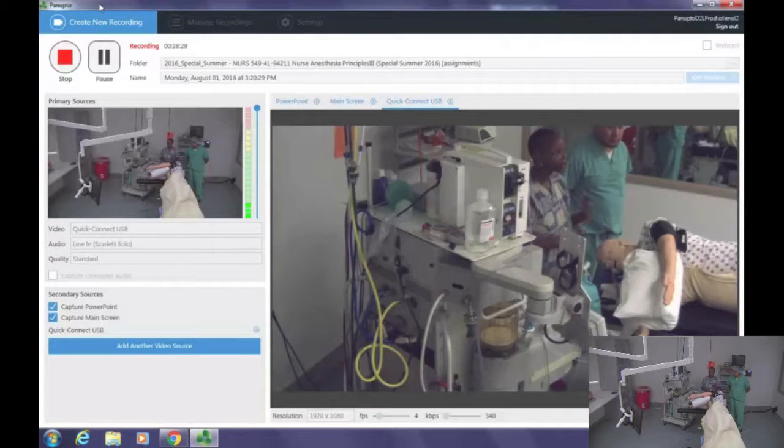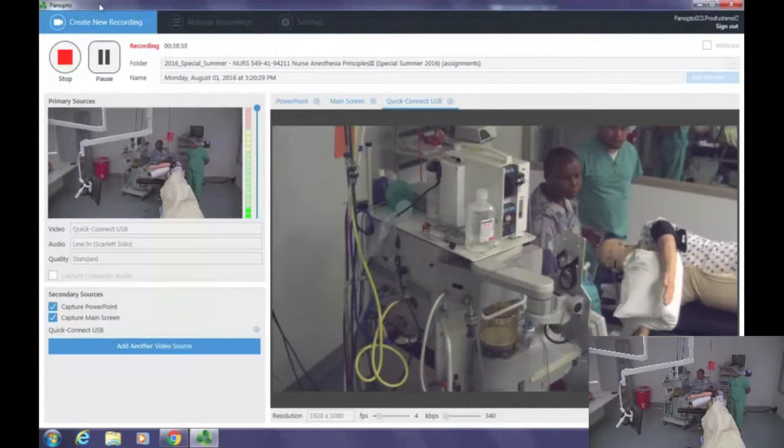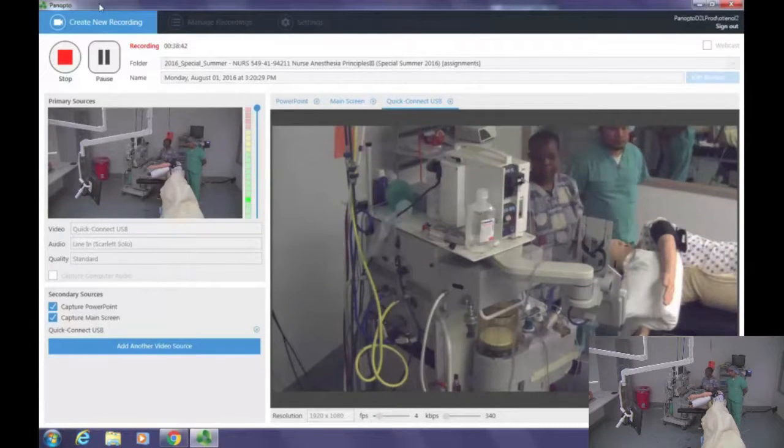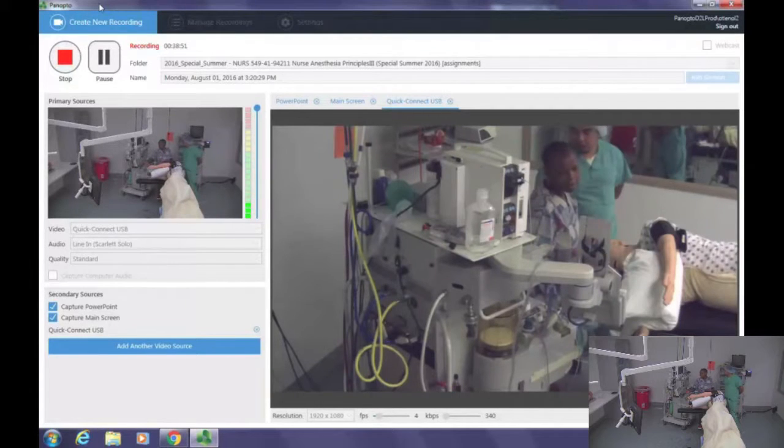Okay. The next thing we're going to talk about is maintenance. Now that the patient is on the vent, as we are doing all these things, we will be monitoring the patient's vital signs. Remember, up until now, the patient is having 2 lungs being ventilated. According to the patient's weight, 550 tidal volume is sufficient, rate of 12, PEEP of about 5, and the patient is on volume control.